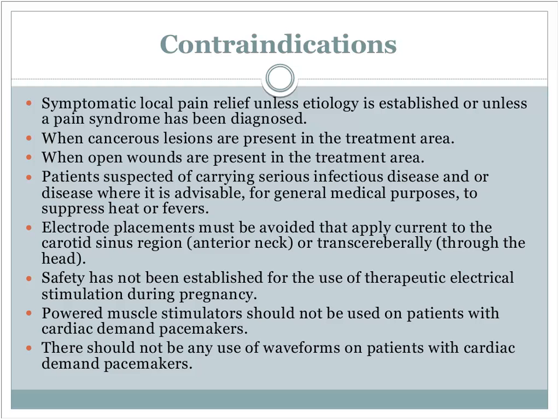I mentioned cancerous lesions. That's point number 2. You don't do it over cancer. It says open wounds. Well, unless you're deliberately treating the wound, because you don't want to interfere with that wound healing process is what it comes down to. You could do TENS around the wound that's painful. There's actually no problem with that. But doing muscle contraction, those kinds of things over an open wound, you're just going to disrupt the wound healing process.